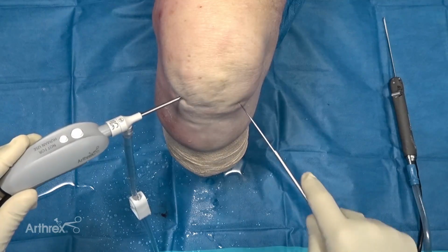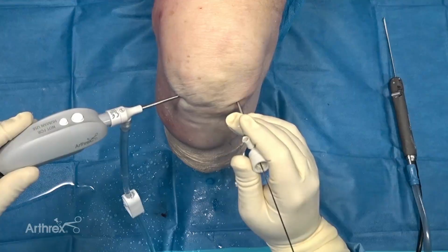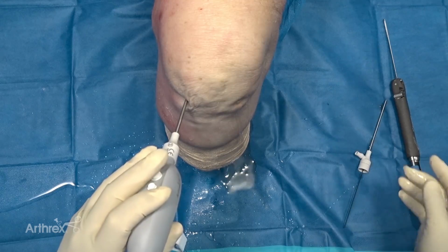So to dilate this portal here, I like to take a standard nanoscopic cannula. So now we have a nanoscopic cannula in the knee on both joint spaces. And so I can take the nanoscope, I can switch it to the medial side, I can switch it back to the lateral side at this point. But what we're going to do in this case is we have a lateral meniscus tear over here that we're going to use the Nanosaber on. And so I'm going to remove this medial cannula. You can see that medial cannula is removed.